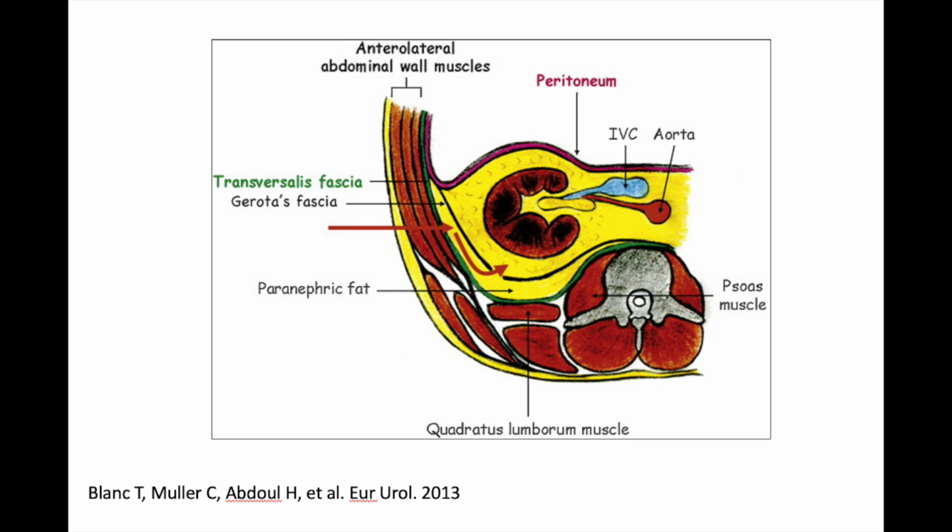possible, and at the same time one must also be careful that he or she doesn't enter the paraspinal or the quadratus lumborum muscles. As you can see, the red arrow depicts the access into the retroperitoneum, which is posterior enough and the insufflation will push the kidney up. Here the surgeon has entered his scope directly into the Gerota's fascia by opening the Gerota's fascia.